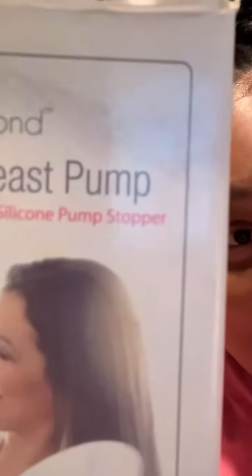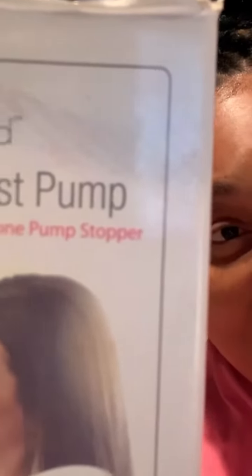My silicone pump was only $9.99 from Amazon. This is the package — of course I opened it — and at first I was skeptical. I was like, how am I supposed to get milk out of that? That's not gonna work.